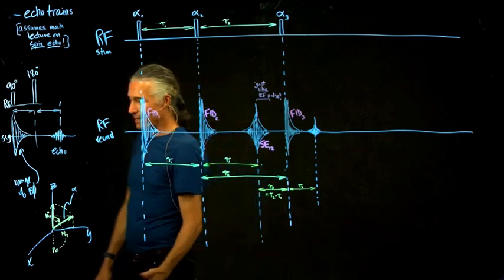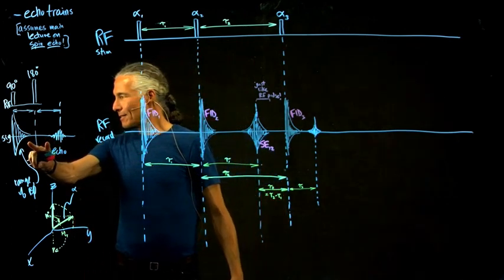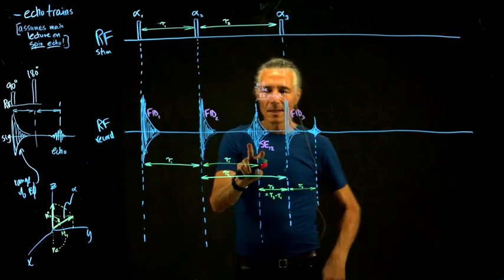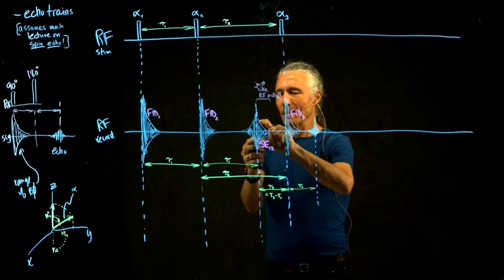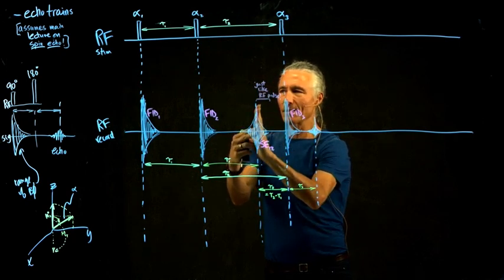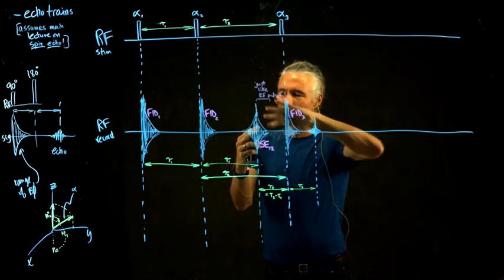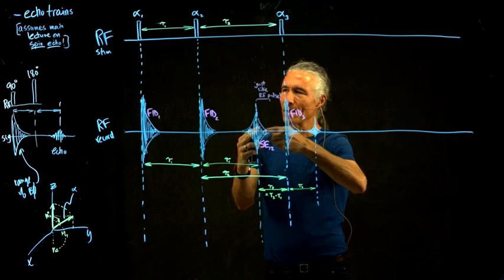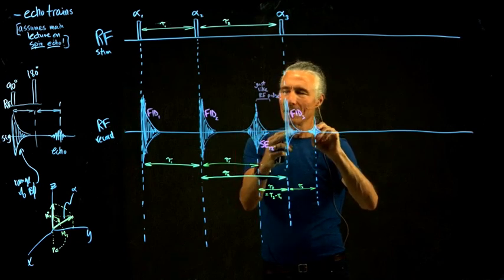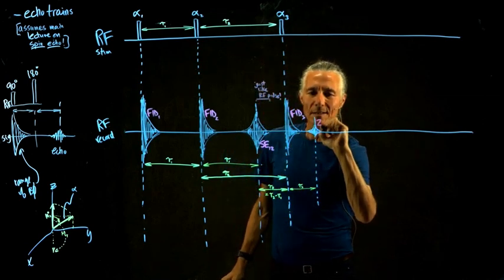So that guy actually does an RF pulse, and then we're going to get another spin echo. The second half of this echo acts just like an RF pulse, because everybody's in phase in the very center, and then they start to get out of phase. And then we do another RF pulse, and that will flip some of these guys around so that the guys that were ahead are now behind, and then they'll cancel out all their phase errors, and then you get another echo. So this guy is called a secondary echo.